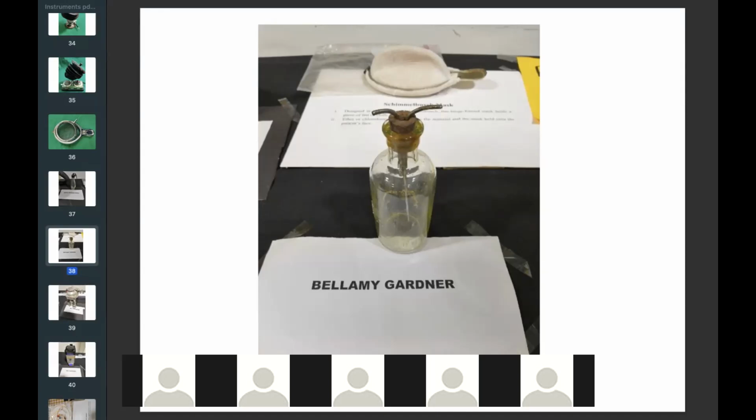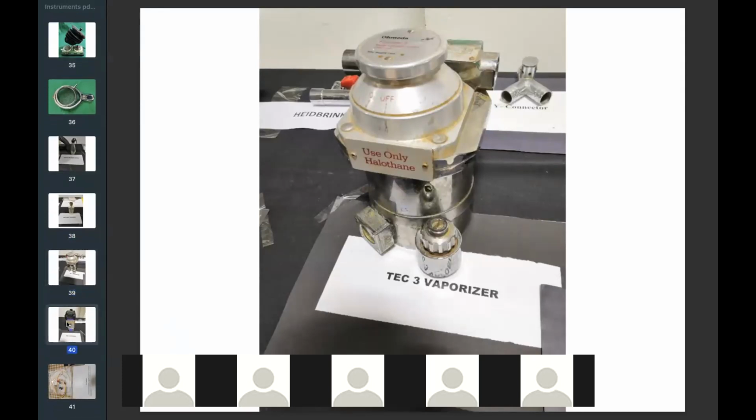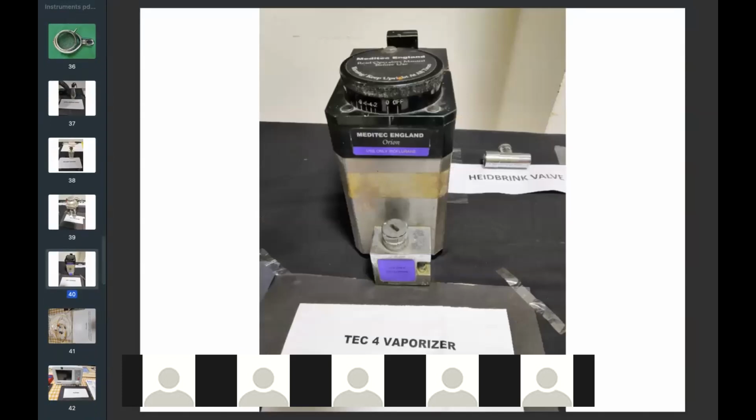Next, is there this thing, the next bottle? No, that bottle is missing. I mean the chloroform bottle which we dealt with right in the beginning, you connect with that bottle and the patient breathes spontaneously. This Mark 1, Mark 2, Mark 3 and all, I told you what all to read. Generally, these are kept in the exam. And you can see, depending on the dials, whether the wicks are dipping into the vaporizing chamber or not, then whether they are flow compensated, flow and temperature compensated, flow compensation to what extent, all that is what we are supposed to talk about.